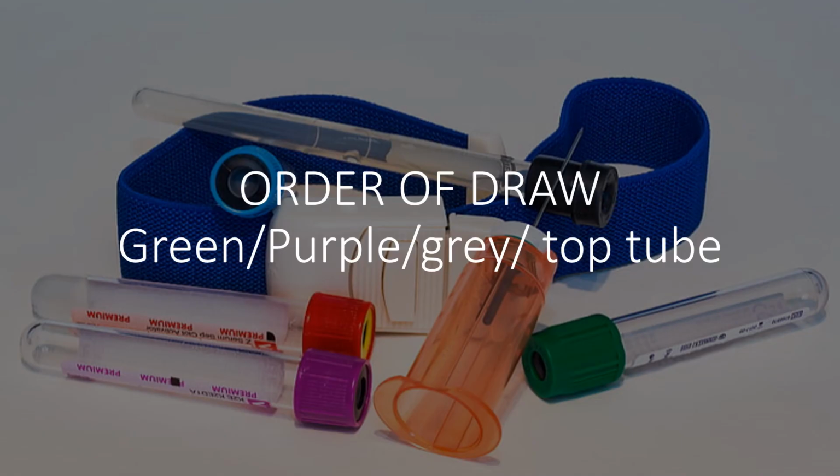Okay, so after that, and you'll see at the end our flower slide. So after we talk about our sun in the sky, which is yellow, which is our blood cultures that we always draw first, then our raindrops coming out of the sky, which is our light blue, because the rain needs to give our flower water to grow, right? So that's our light blue top that you draw next. And remember, the only time we draw out of order is the example I provided when we need to use a discard tube. So after the light blue, then we have our red, then we have our SST, right? Then we have our stem of our flower, which is green. So the next tube in the order of draw is the green top tube.